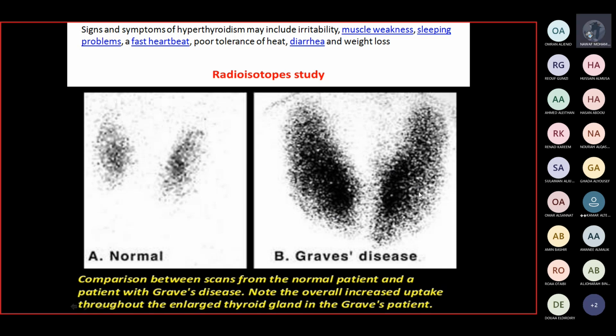I think there's increased thyroid function. Yes, there is increased uptake of this radioisotope. And also you can see the size. Compare the size. It's a lot bigger, yes, larger compared to the left. There is enlargement of both thyroid glands with increased uptake. But this is Graves' disease.